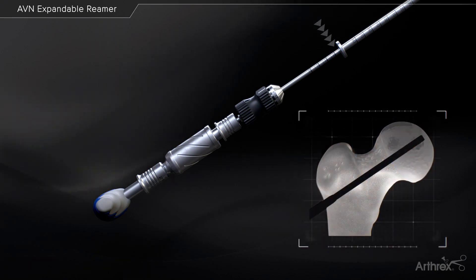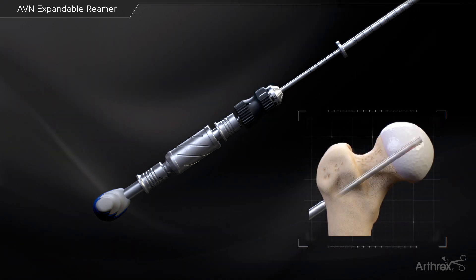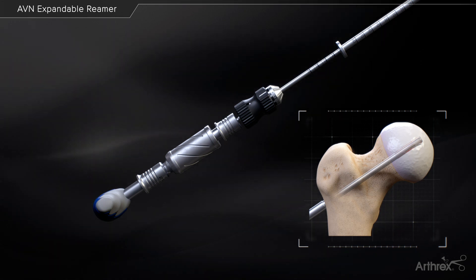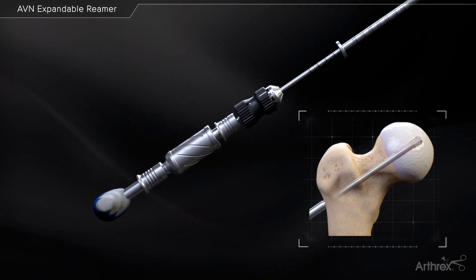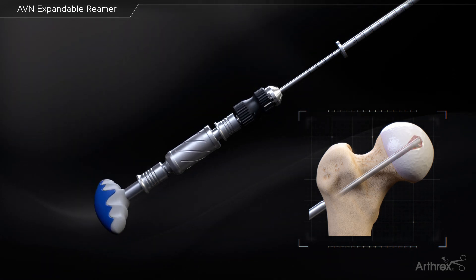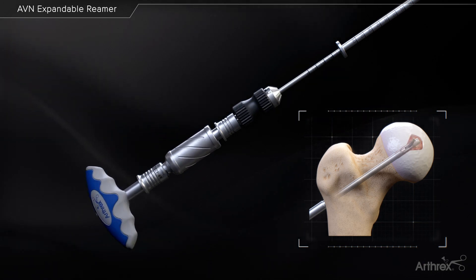The socket depth can be referenced off the 5 mm drill sleeve. Open the blade by twisting the knurled portion of the expandable reamer clockwise until a click is felt. Twist the expandable reamer clockwise and counterclockwise until no resistance is felt. Incrementally adjust the expandable reamer one click at a time until the desired socket diameter is achieved to remove all of the necrotic bone.